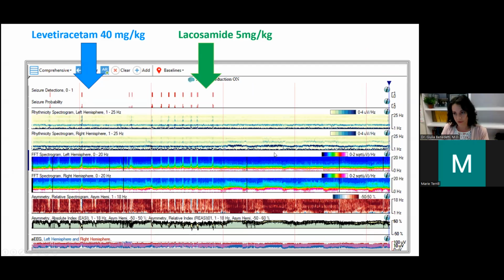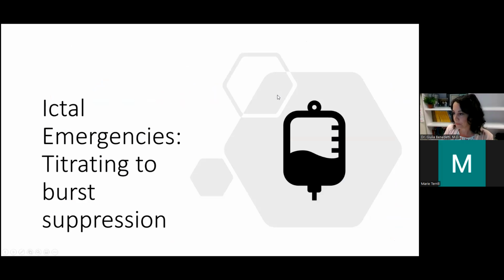So now that I've confirmed that the seizure shows up on the quantitative EEG, I like to condense it. And this is a 12-hour view of his EEG. And then I will often just plot out what medicines they've been given. So we tried levetiracetam after he had 2 seizures, and it helped for a few hours, but then they came back, and they came back quite frequently. So we tried lacosamide, and you can see that then more than 6 hours later, no seizures. It worked really well for him. So then I know the sodium channel action is probably the one that's going to work for him.